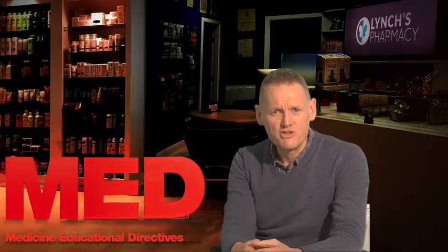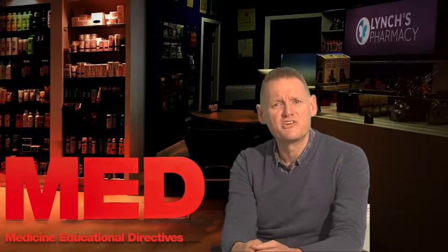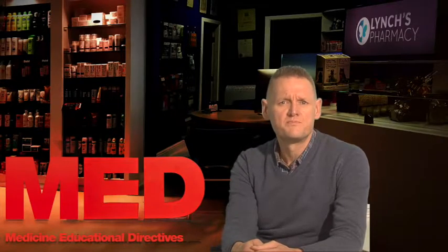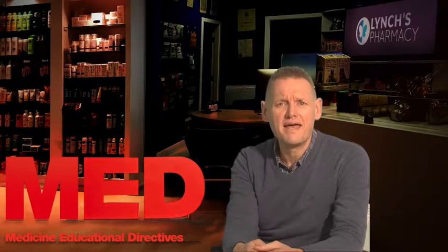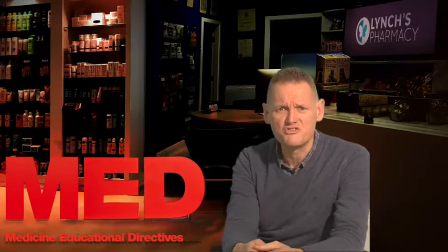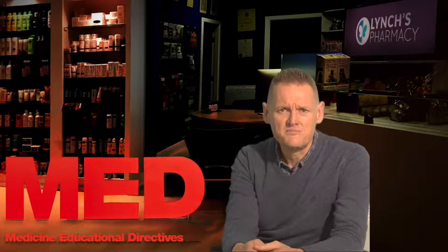So what is Apidra used for? It's used for diabetes in adults and children aged 6 years and older. And how does it work? Apidra SoloStar pre-fill pens and Apidra penfill cartridges contain the active ingredient insulin glulisine. They are used to treat diabetes.